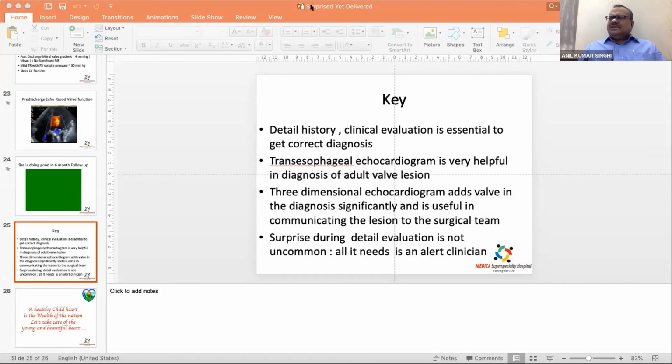Septal total length used to get measured earlier, nowadays no. The right atrium is so dilated, and the device is soft. Usually it accommodates and reforms to the heart shape. It is never an issue in the long-term follow-up. I have 3 years data, all the patients are on active follow-up, and to my surprise, it was difficult to understand that it is the same device which I put. So they usually remodel nicely.